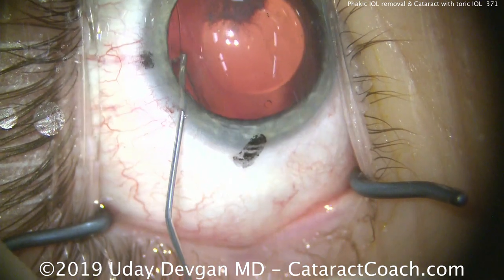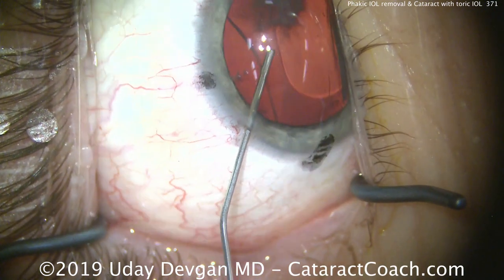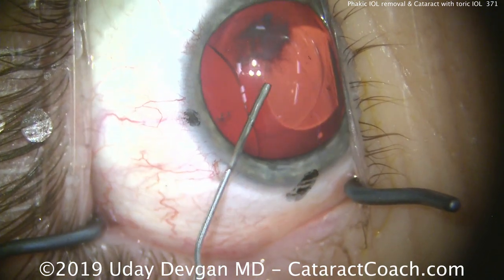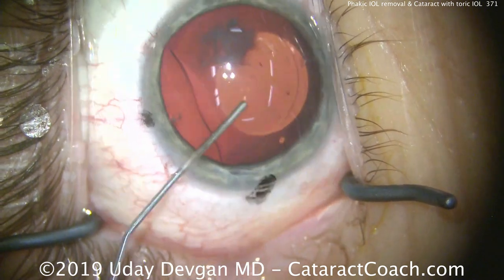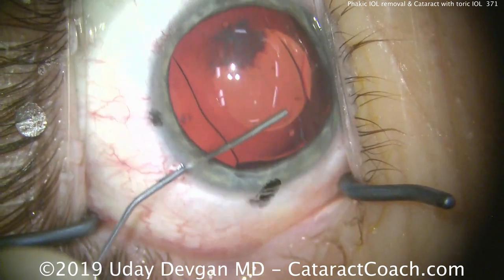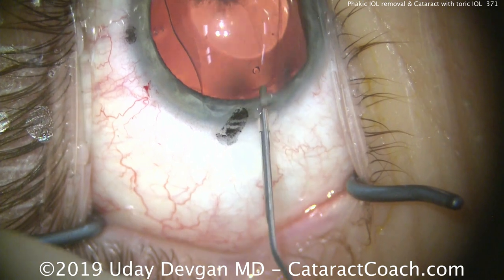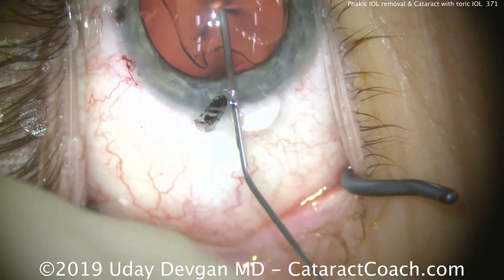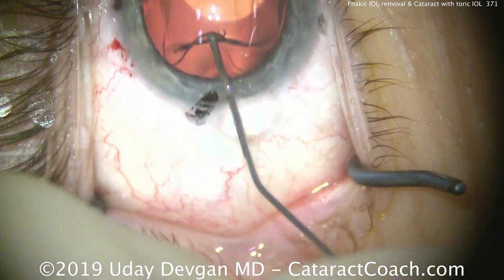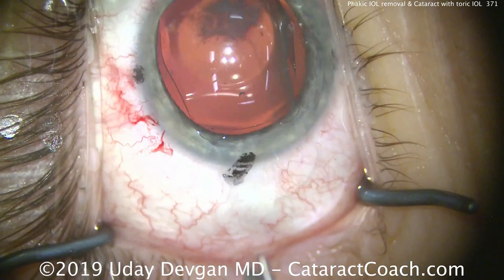We're going to lift up the lens and inject dispersive viscoelastic underneath the phakic IOL. It's important that you don't damage the anterior lens capsule, so nice and easy. We'll lift this lens out of the touch area, and use more viscoelastic to free it and get it out of the sulcus area. Now we have our phakic IOL with viscoelastic above and beneath it.